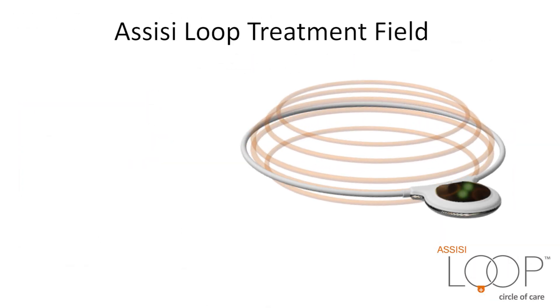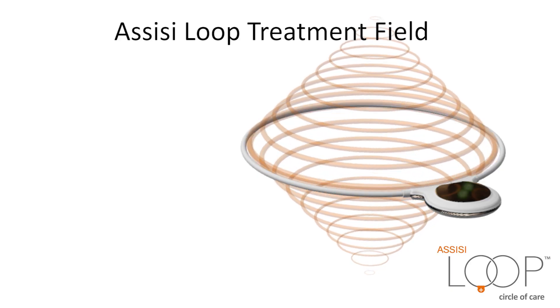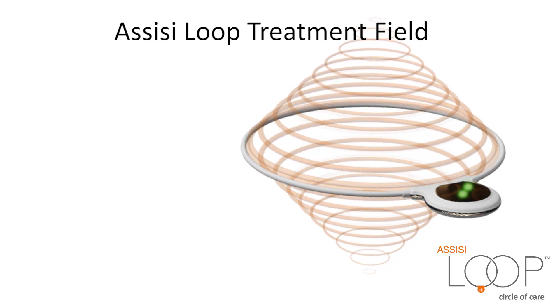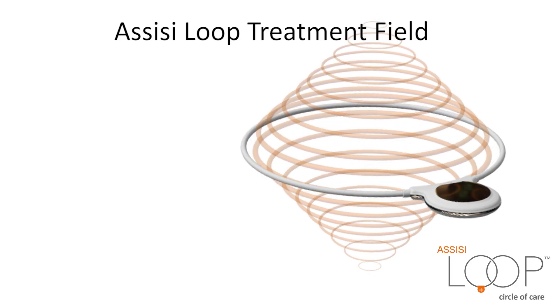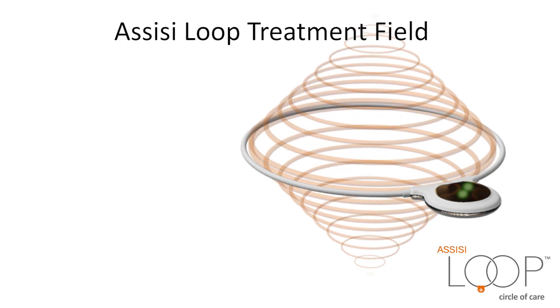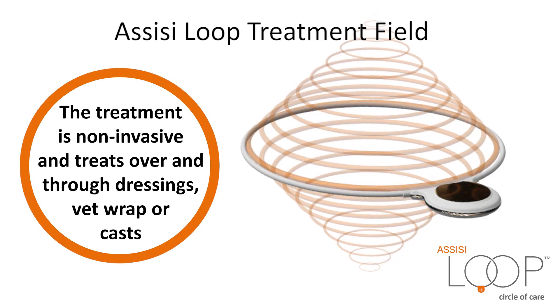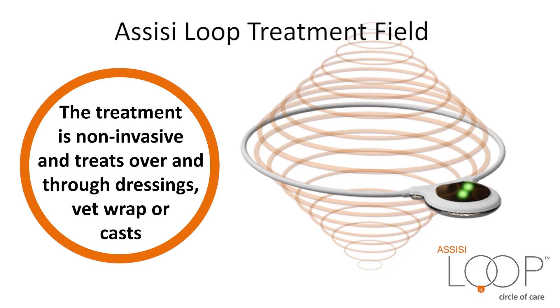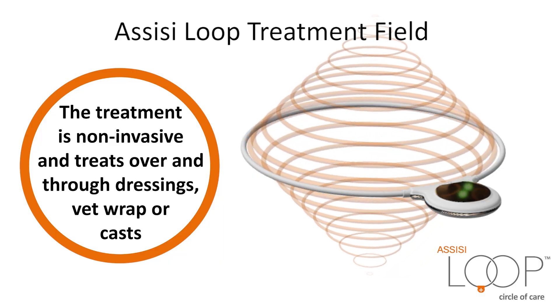Assisi Loop Treatment Field: The treatment depth is about two-thirds the diameter of the applicator, extending out on either side. In this seven-and-a-half-inch applicator, treatment volume is about seven inches across and four to five inches on either side. The treatment is non-invasive and treats over and through dressings, vet wrap, or casts.